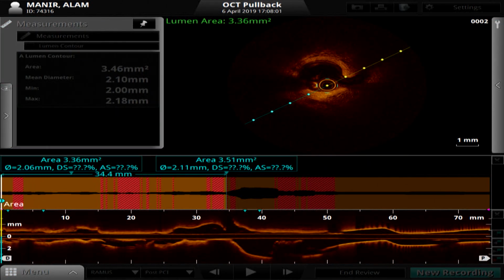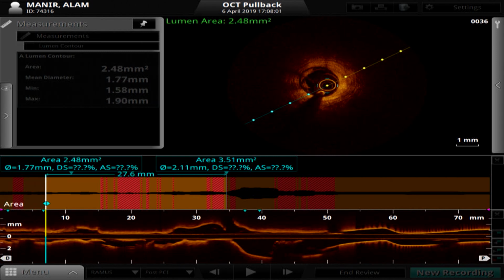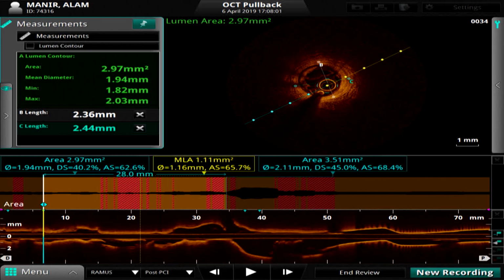We post dilate that, no? Yes, we will have to post dilate in the proximal segment with a 3.0 because there is a taper in the ramus. The reference lumen is 2.5, ostially it is 3.0. So we'll put a 2.5 stent in and post dilate at the ostium. So you're going by the external elastic lamina to external elastic lamina, correct? Yeah, correct. It's about 2.44 EEL. So once we put it, it's easily 2.5 without a doubt.